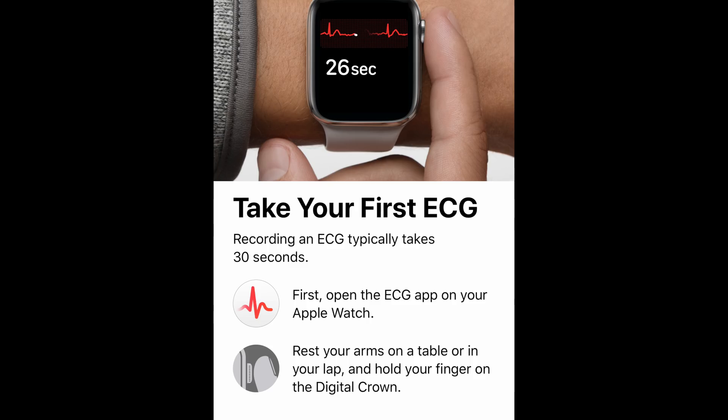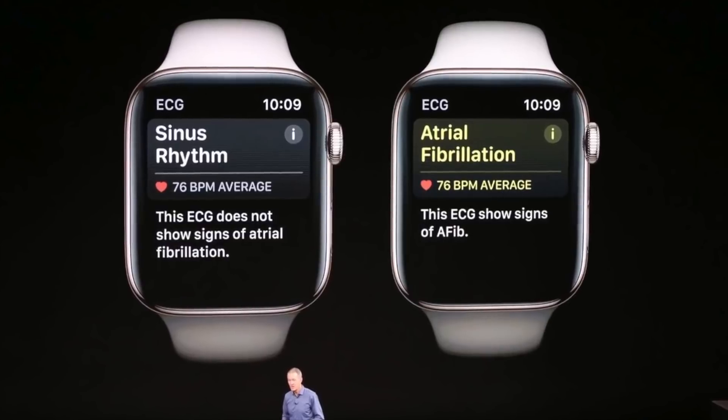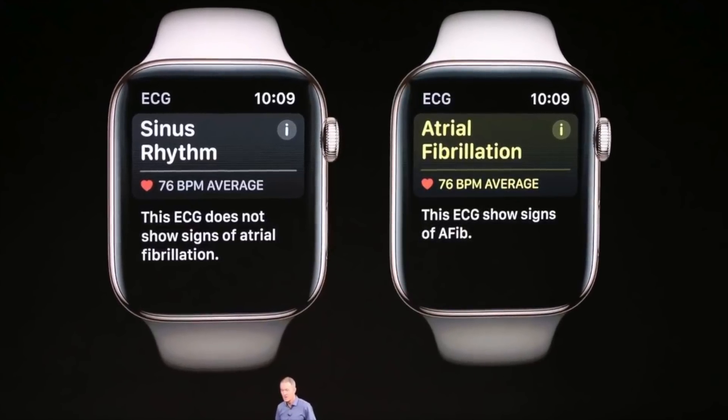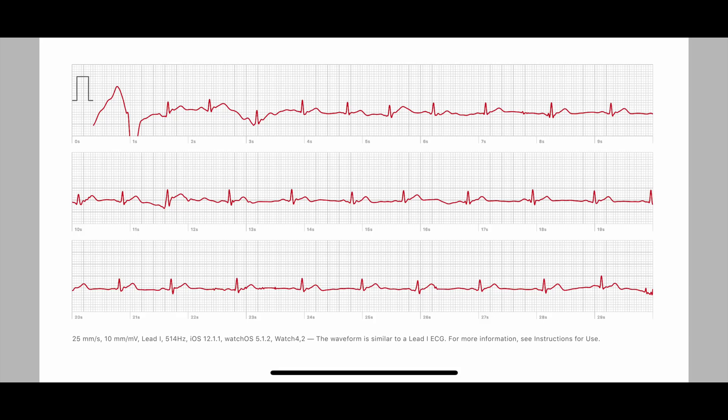The reading typically takes about 30 seconds. The first few seconds while you're moving your arms a little bit won't really count. After the reading, you'll be greeted with one of two conclusions: either that you have AFib or that you don't. All of that data will be synced to the app, where you can review the actual graphs and even export it as a PDF to give to your doctor for further review.